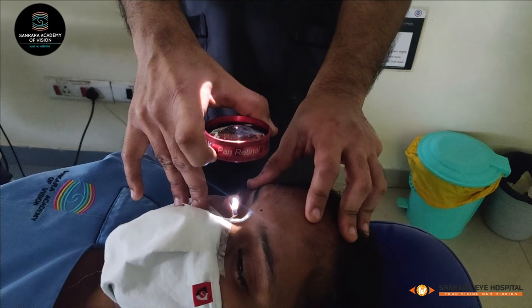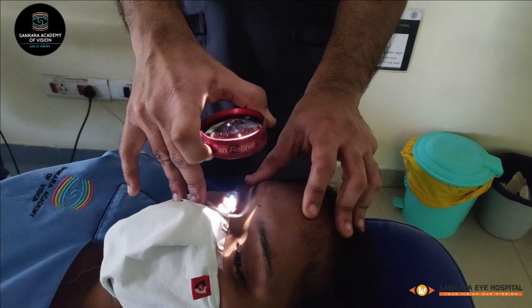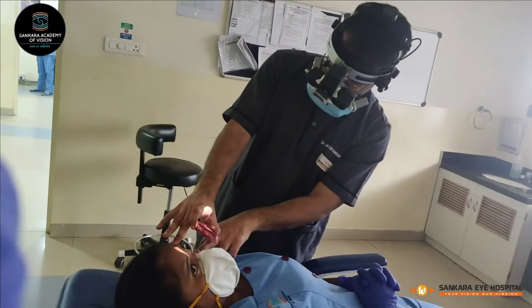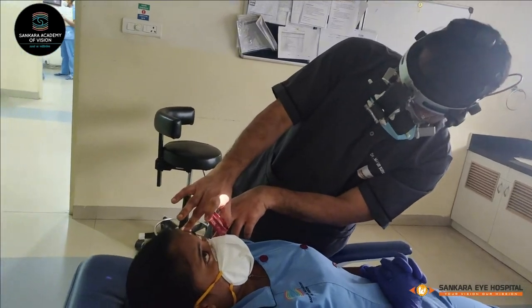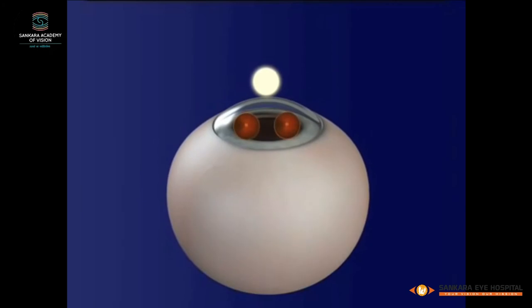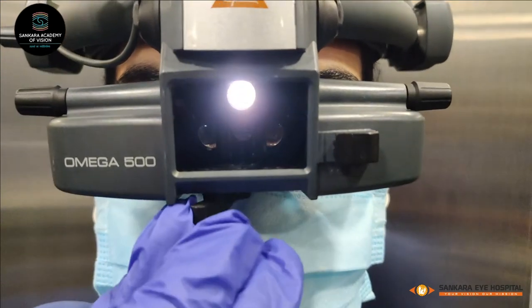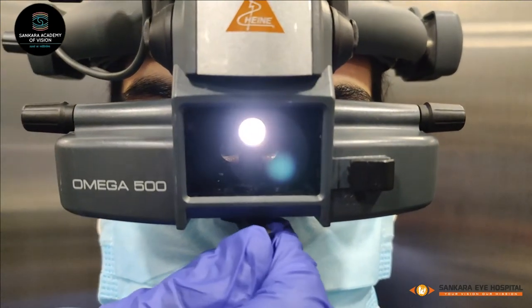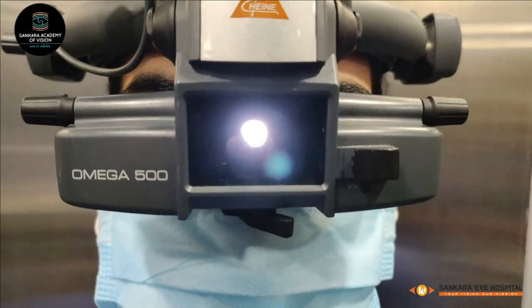Examination of the more sensitive posterior pole should be left until last. Examination of the peripheral retina is a challenge in extremes of gaze because the shape of the pupil becomes elliptical and cuts off the illumination beam, making visualization of the fundus difficult. The variable pupil function as described earlier can be helpful in such situations.